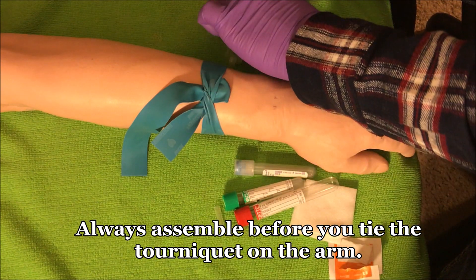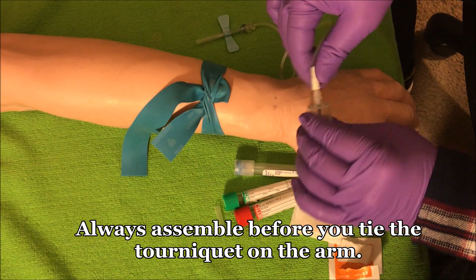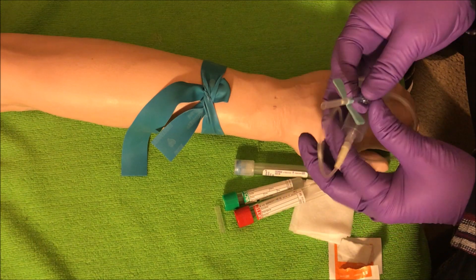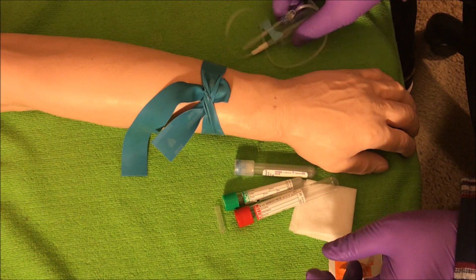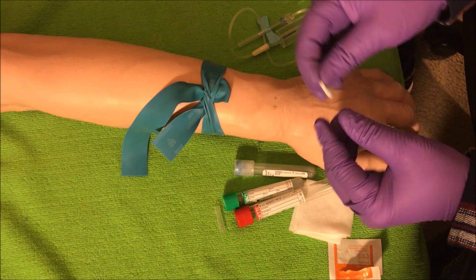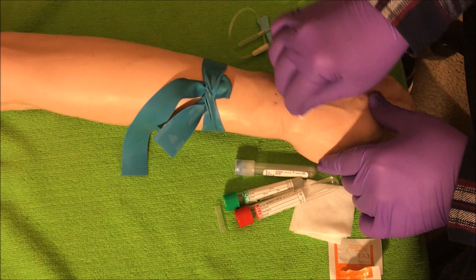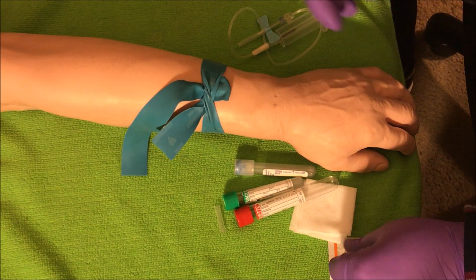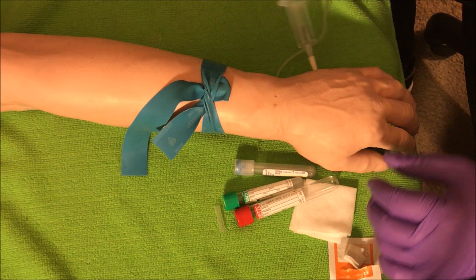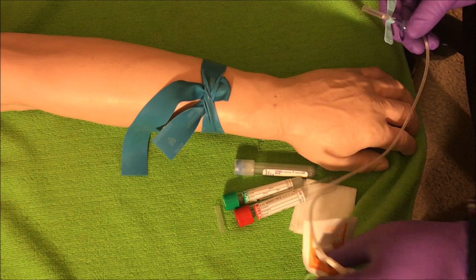The assembly is always the same. I take the sheet off, get my vacutainer holder, attach it the same way — screw it in and ready to go. This does have a plastic sheet over the needle. Once my equipment is ready and tourniquet is on, I fold my alcohol prep pad in quarters and work from the center out. If I'm locating my vein right here, I go three to four times center out. I do not rub over the site — that's a no-no, as discussed in the straight needle draw.